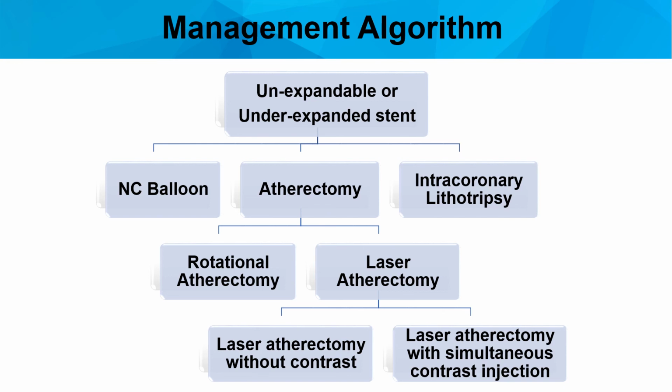It is important to pay attention to the time that is involved in the intracoronary lithotripsy, because during that time of balloon inflation to deliver the acoustic shock waves, the vessel may be occlusive to blood flow, and so there could be some ischemic changes.